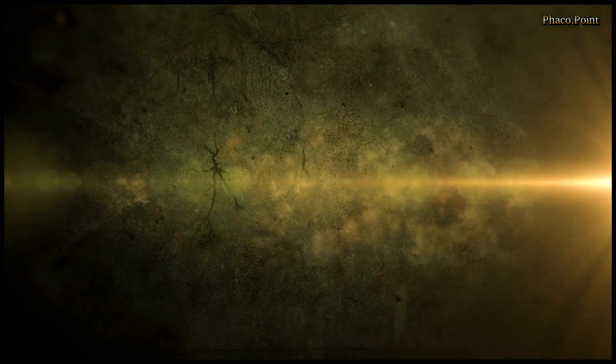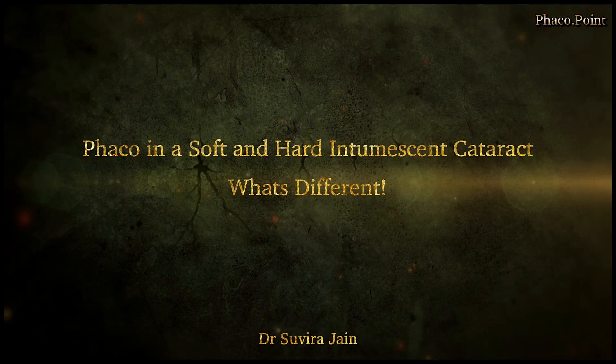In this video I'd like to discuss the differences in the surgical management of two types of patients with intumescent cataract. One, an intumescent cataract that occurs very early in life, something like a traumatic cataract in an 18-year-old patient, as well as the second which is an intumescent cataract in a 60-year-old. Let's see how both these cases differ.